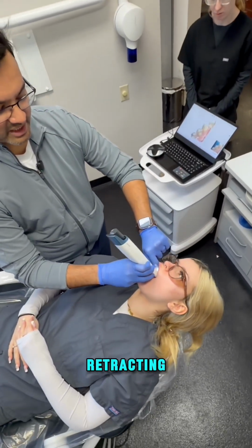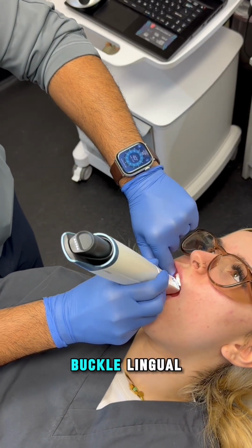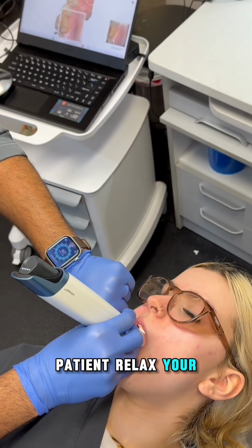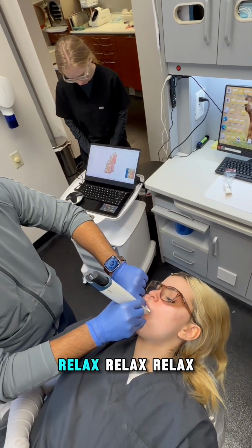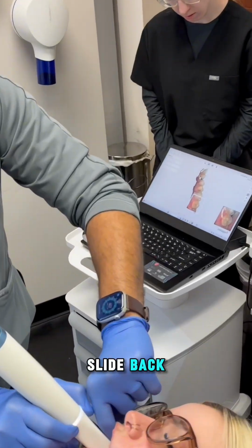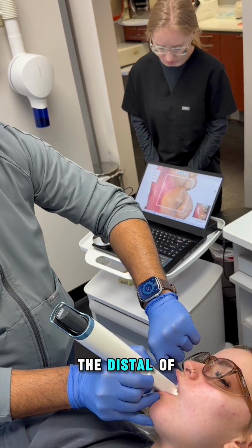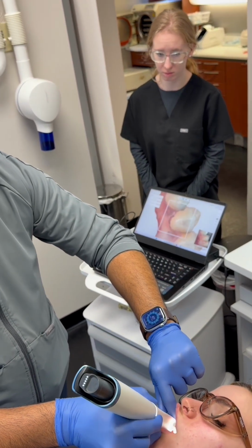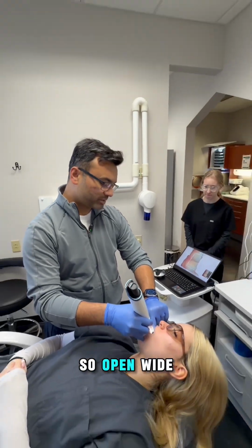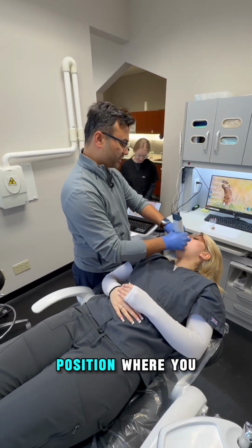My finger keeps retracting. We are going buccal, lingual, buccal, lingual. Now, when I come back to the molar, I'll tell the patient, relax your jaw a little bit. Relax, relax, relax. And now my scanner will easily slide back. And while the patient is relaxing, I'm going to turn the camera in. So I got the distal of my second molar. Now I bring it forward again. If the patient is relaxed, there is not enough mouth opening, so open wide. Good. And now you got back to the same position where you scanned in.